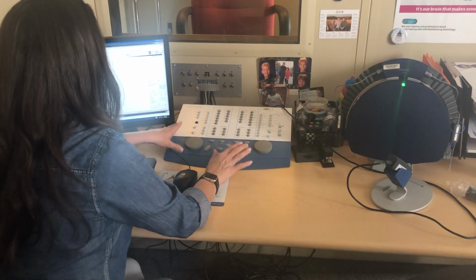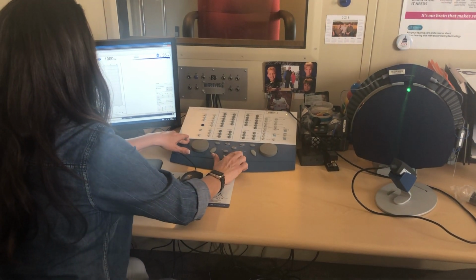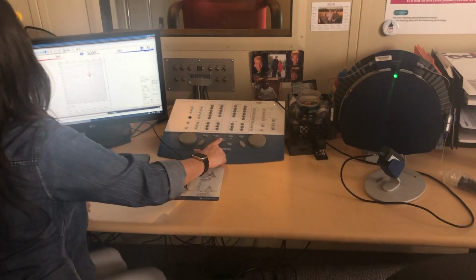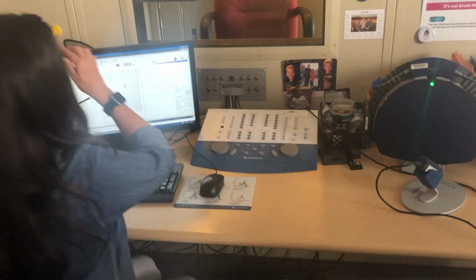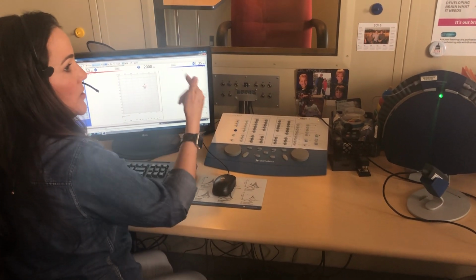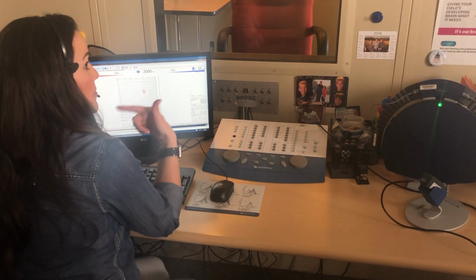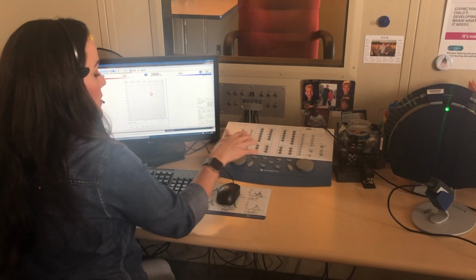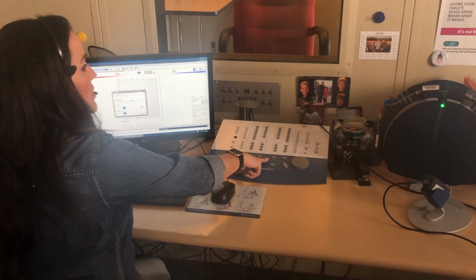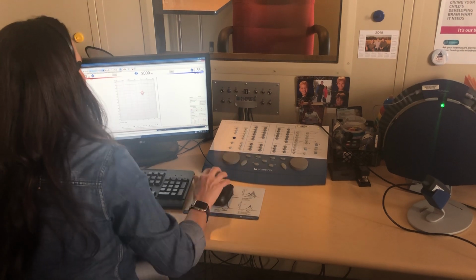Same thing, you just kind of have to get your bearings, but the frequency is here, the buttons from side to side. Talk forward is this button here in the middle. What that means, and you'll need to wear this headset while you're testing, and there's a microphone in the booth that allows you to communicate with your patient. You're going to hear them regardless whether it's on or not, but if you want to talk, you're going to push talk forward, and now my patient can hear me giving instructions through their earphones, okay?